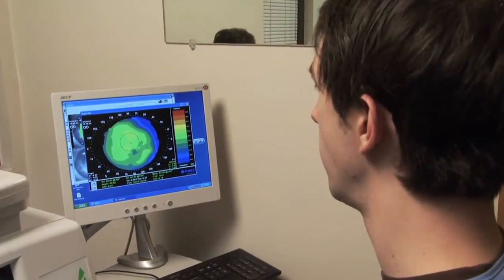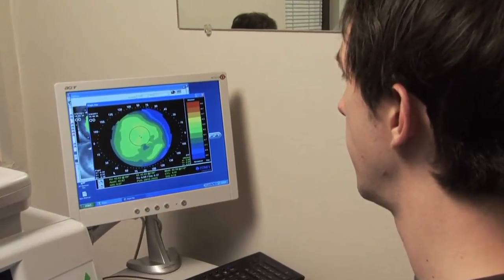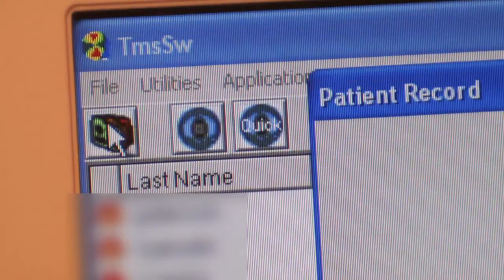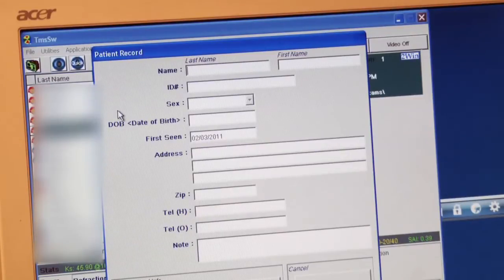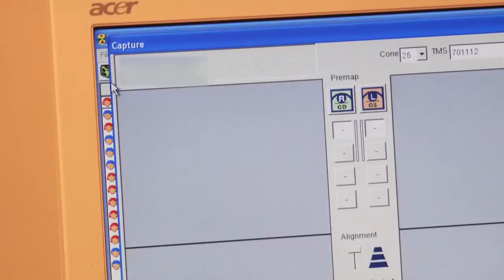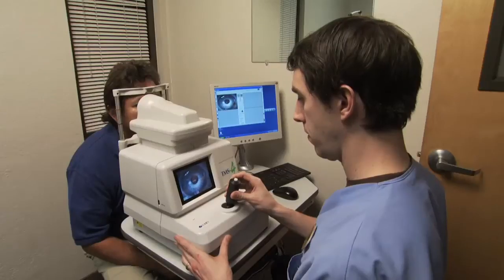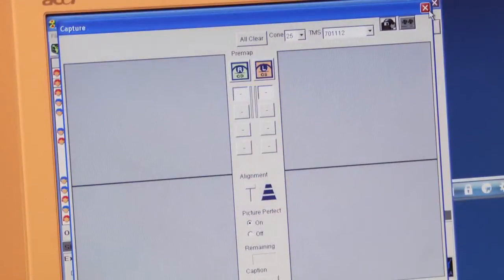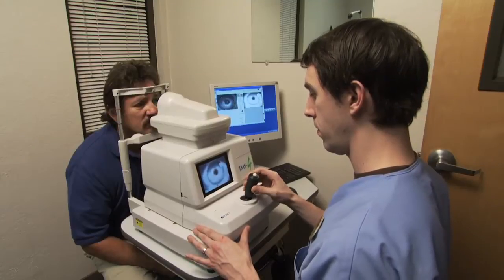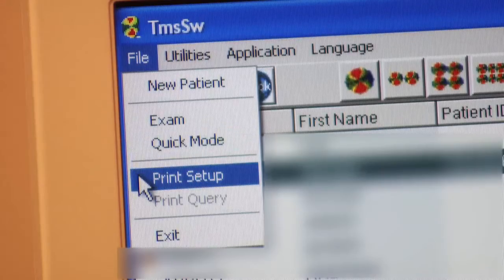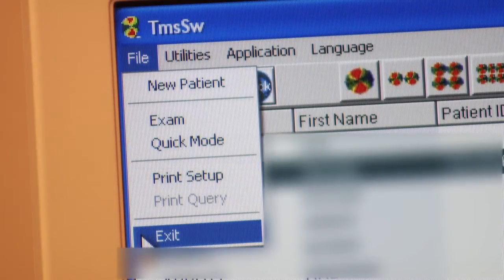There are eight pull-down menus on the TMS-4 software. The first one is File. This menu contains four selections: New Patient, which allows you to set up a new patient; Exam, which starts the exam process; Quick Mode, which allows you to initiate an exam without entering a patient name — after the exam you have a choice of discarding it or saving it in a previous patient's file; Print Setup, to set up any printer attached to the computer; and Exit, to exit from the program.